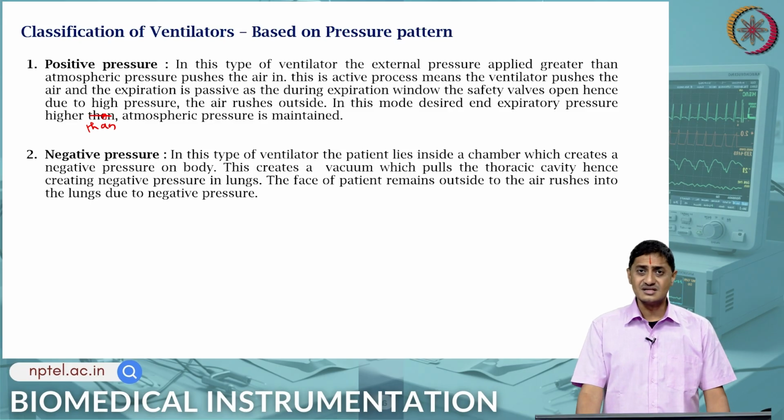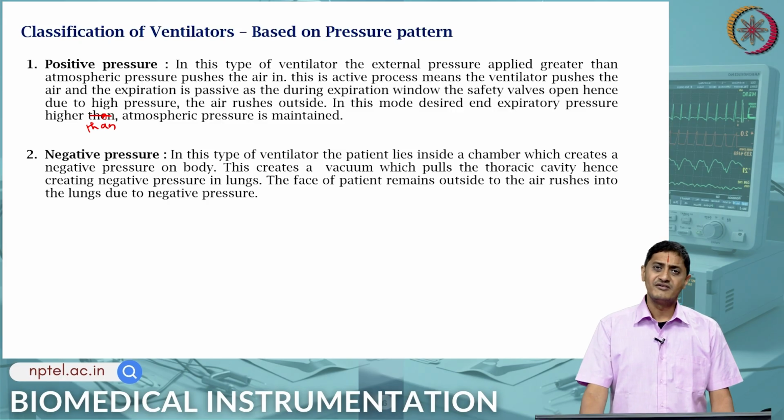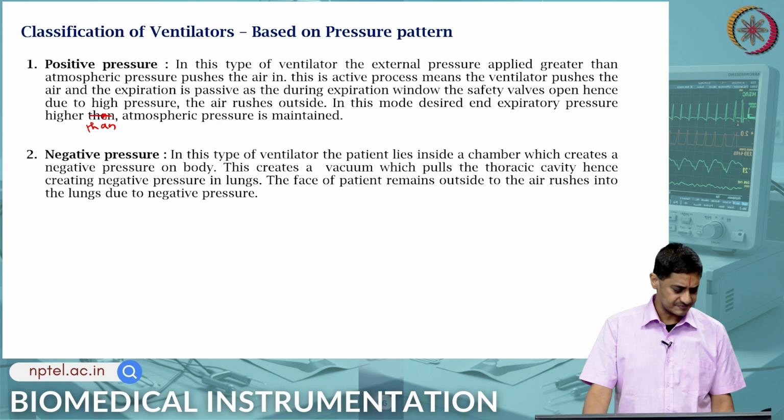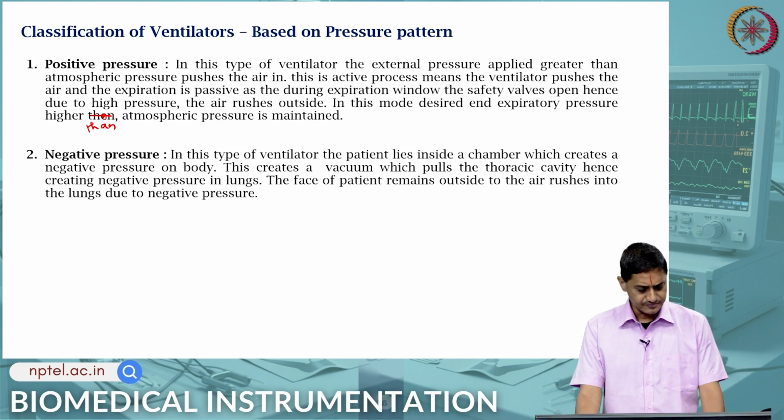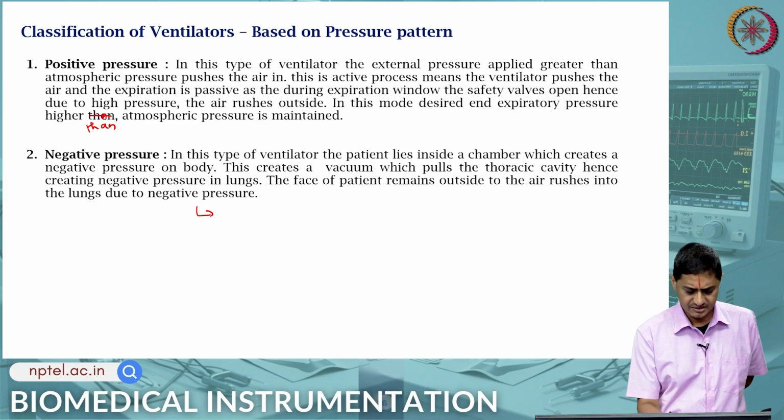Surprisingly, there are still some cases where negative pressure ventilators are still being used or still have their applications. What are these cases? Cases in which, for example, neuromuscular diseases.